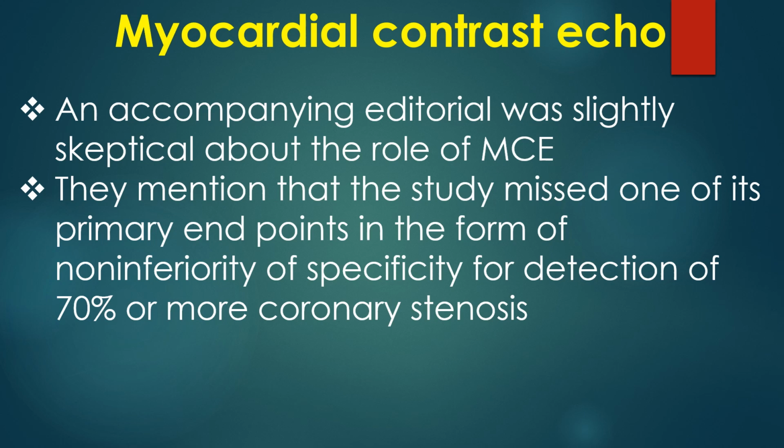An accompanying editorial was slightly skeptical about the role of myocardial contrast echocardiography. They mentioned that the study missed one of its primary endpoints in the form of non-inferiority of specificity for detection of 70% or more coronary stenosis.